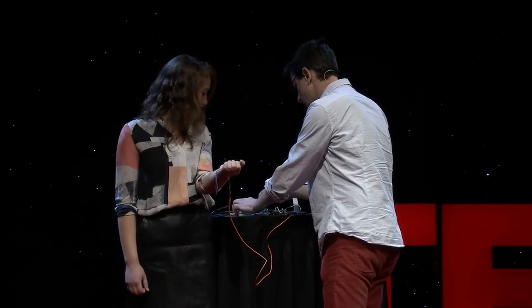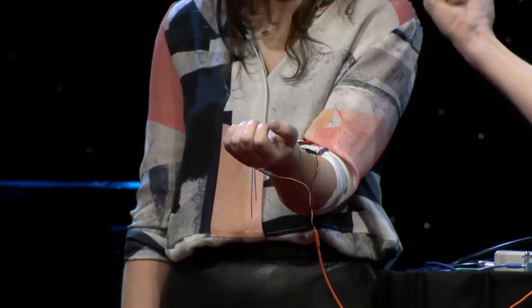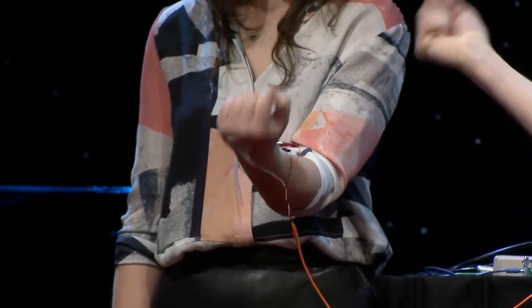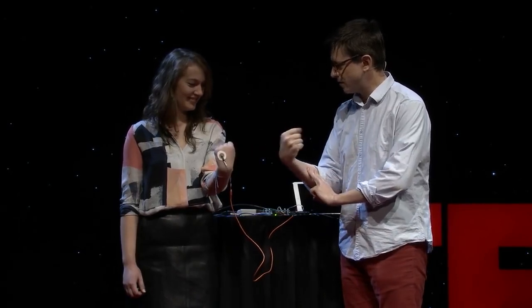So I'm going to turn this on for a second. Have you ever heard what your brain sounds like? No. All right, let's turn it on. Go ahead and squeeze your hand. So what you're listening to — these are your motor units that are happening right here.